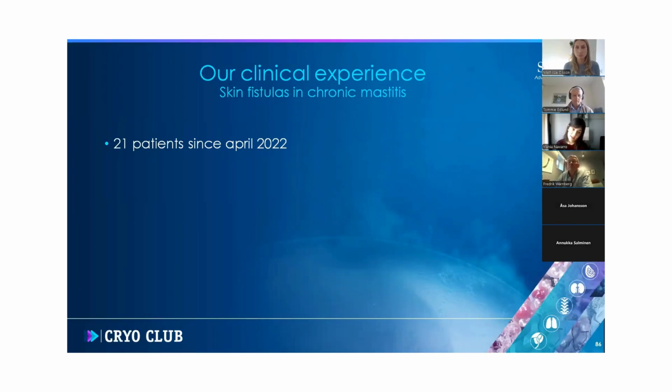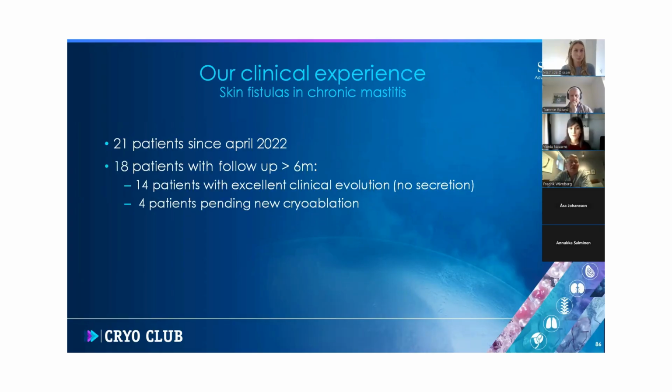We started doing this in April 2022 with that first patient. And so far we have treated 21 patients. Again, it is not that infrequent. With a follow-up of at least 6 months, we have 18 patients, 14 patients with an excellent clinical evolution, meaning no secretion at all.